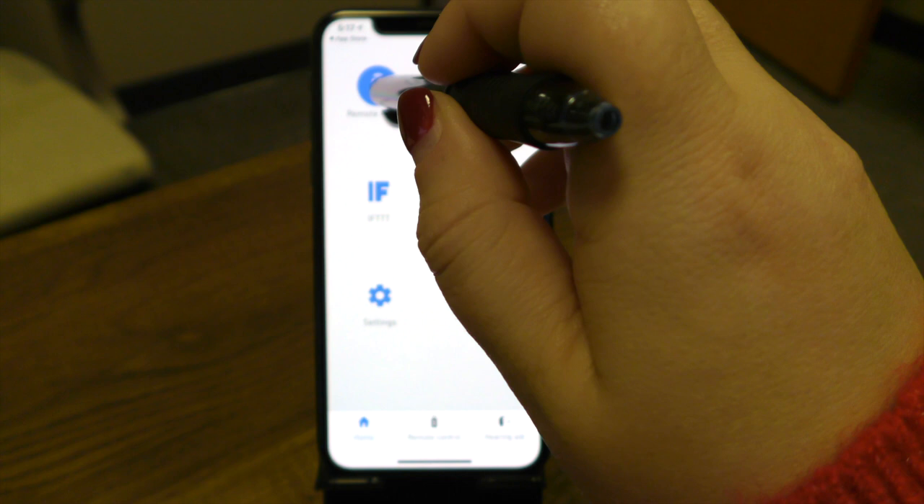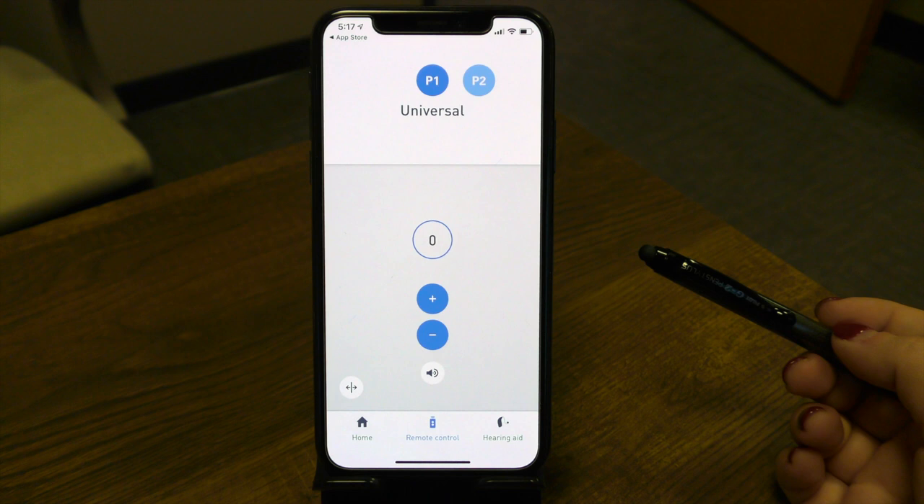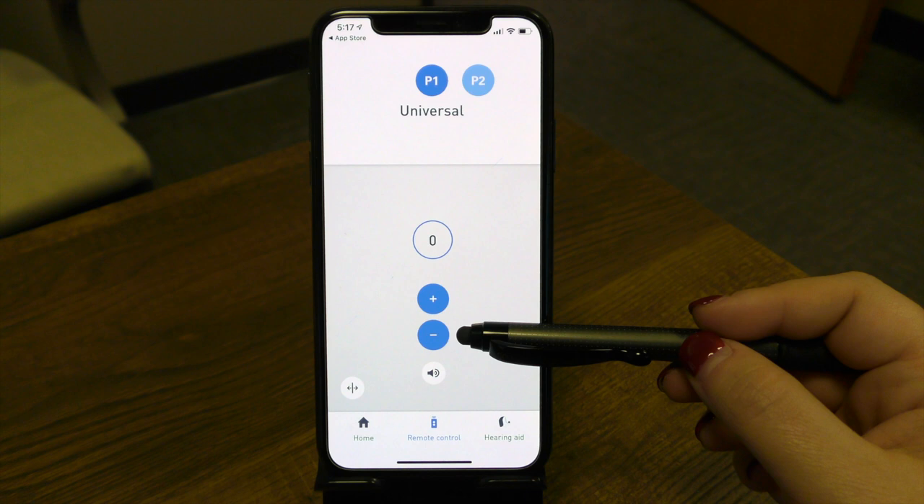Let's start with our remote control. I think you'll find this is the most obvious to use — simply to turn volume up and down, because that's what we associate with the remote control. If you're looking to increase the volume of your hearing devices, you're going to press the plus sign here. For the bottom button, if you need to turn down the hearing device, you're going to press the minus sign.